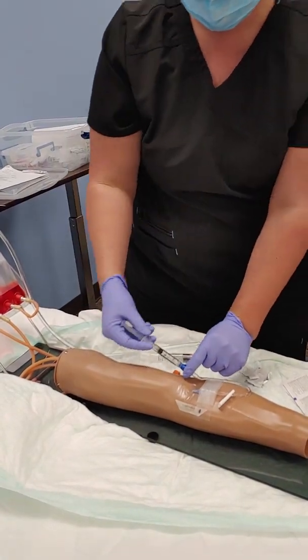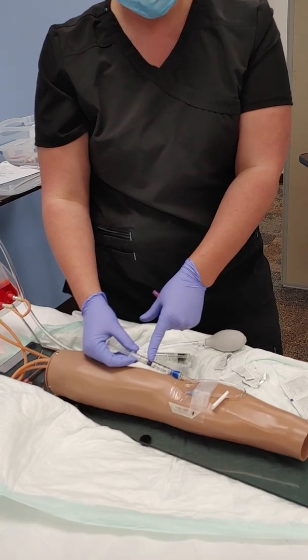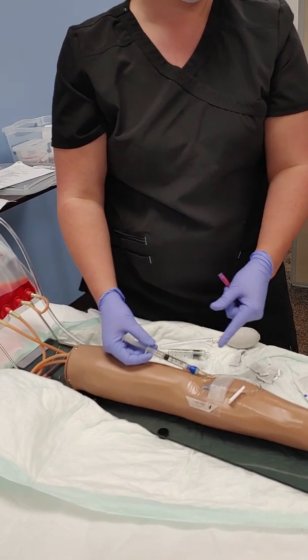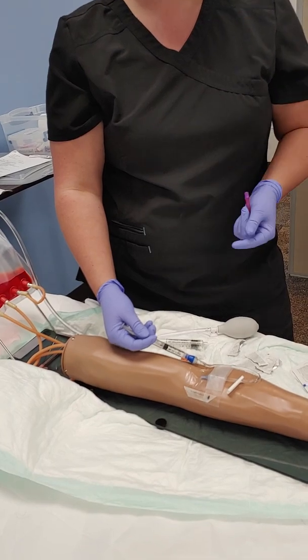This is going to go in over a minute. So I have 2 milliliters to go in over a minute. That means 1 milliliter goes in about 30 seconds, so half a milliliter goes in about every 15. Okay, so kind of keep an eye on the clock. If they're watching Jeopardy, you can play along with them.